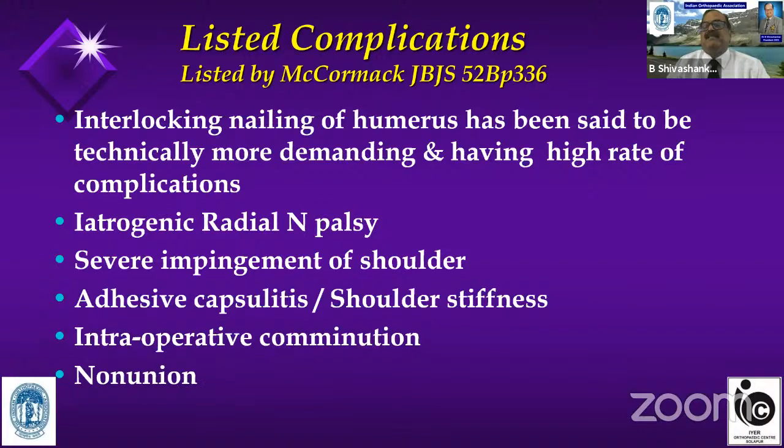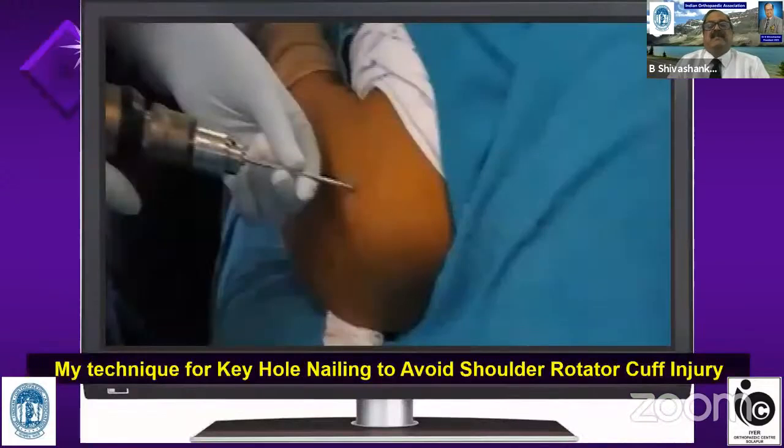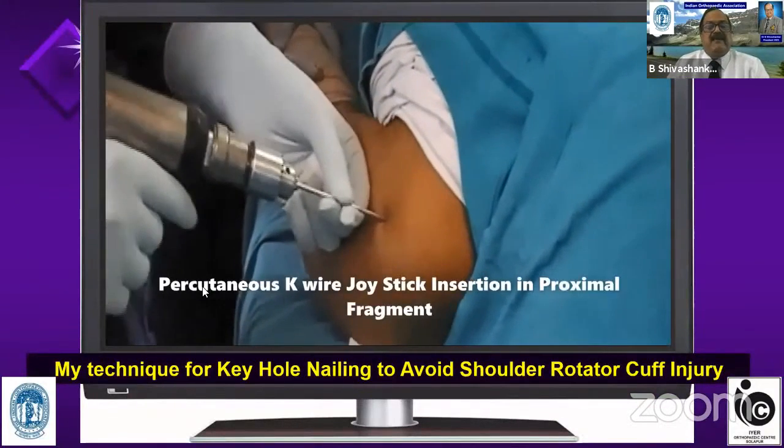Probably this is the paper which has done more damage to nailing than anything else. Friends, I believe that it's the technique. All surgical techniques are good if well executed, knowing the principle behind it. They will definitely end with a good result. The aim of our surgery should be to avoid complications, as many are due to technical problems and not due to interlocking nailing per se. So that is the reason why I said, let me talk more about how I do my surgery rather than anything else.